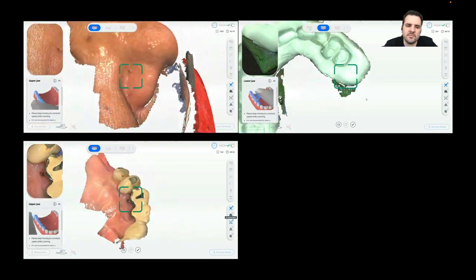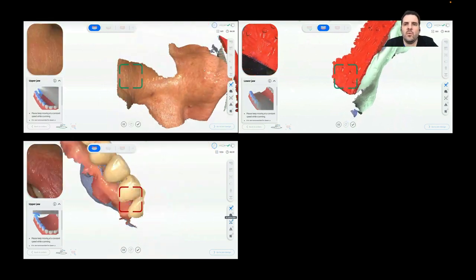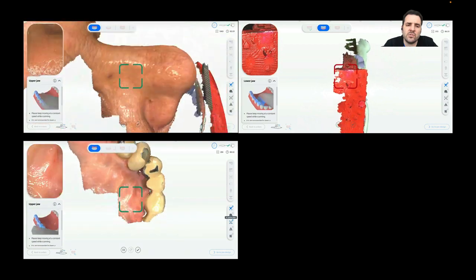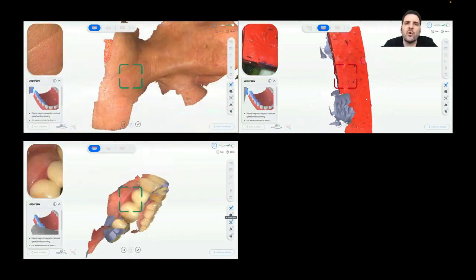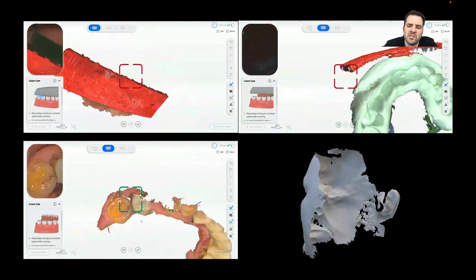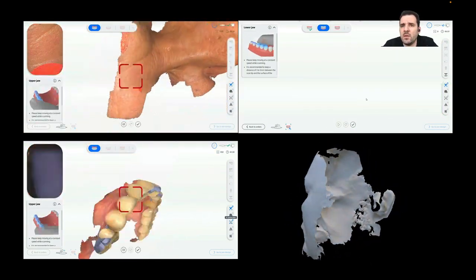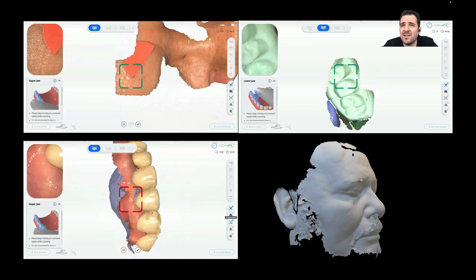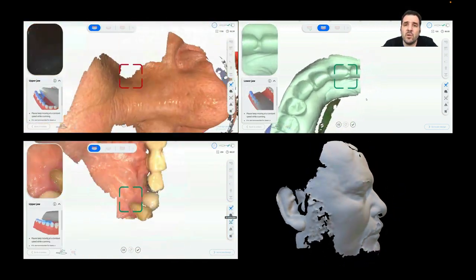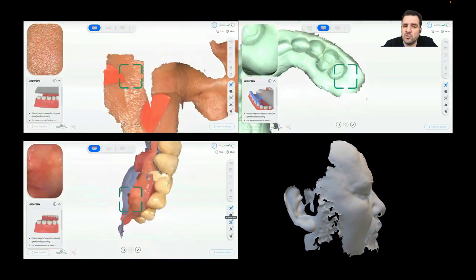After scanning that, we scanned the intraoral anatomy with our intraoral scanners, or we took some impressions and then digitized those impressions. And after all that, what we did was merge that with the facial scan. This is a nice way to work. Maybe it might take a lot of time for the clinician, but when we wanted to work with the virtual patient, this was the way to do it.